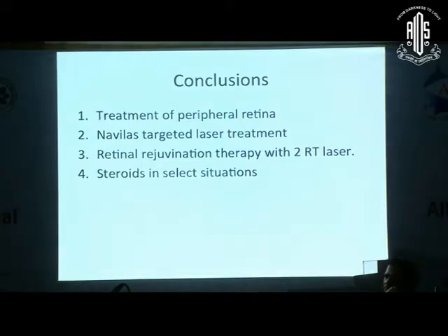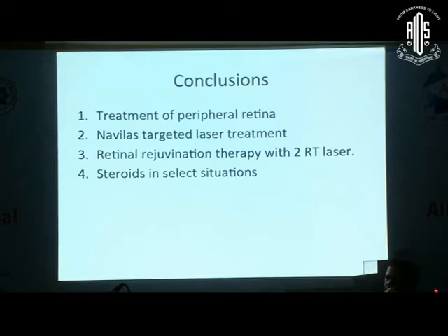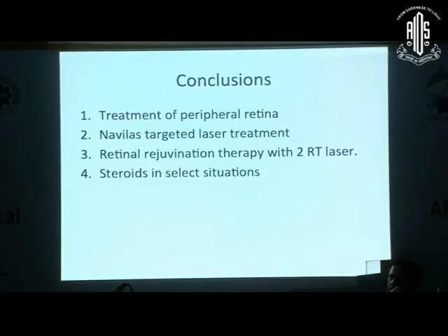So to conclude, in a nutshell, regarding treatment of the peripheral retina, we are getting mixed reports on whether it helps in the management of macular edema or not, but it certainly helps in reducing the number of injections required for the macular edema. Then Navilas targeted laser treatment is effective, safe, and for the youngsters and the inexperienced, it can prevent inadvertent macular burns. I'm not touching on the rejuvenation therapies because Ajay is going to talk about micropulse. And steroids in select situations, once you have checked the IOP and everything is normal, are still a very good tool. Thank you very much.